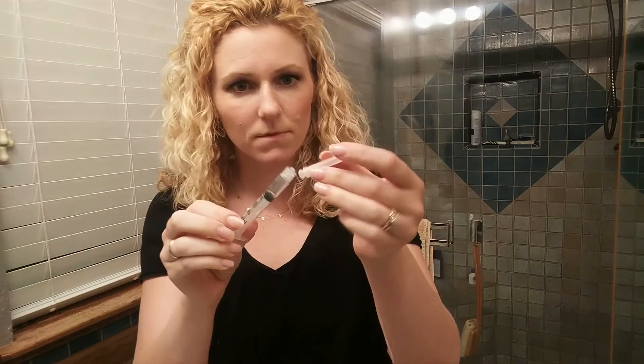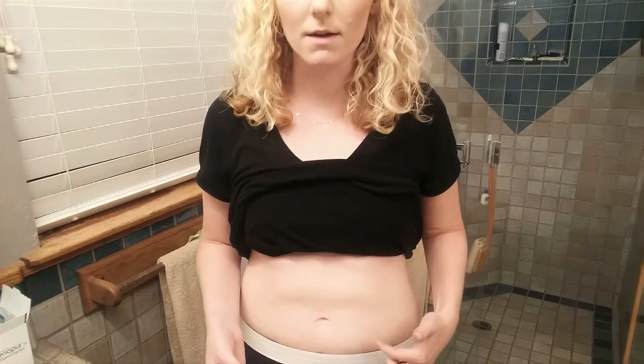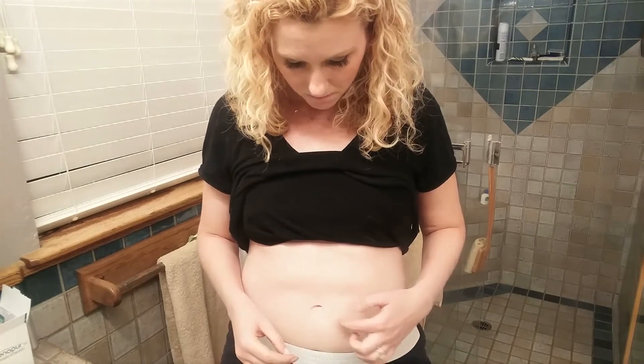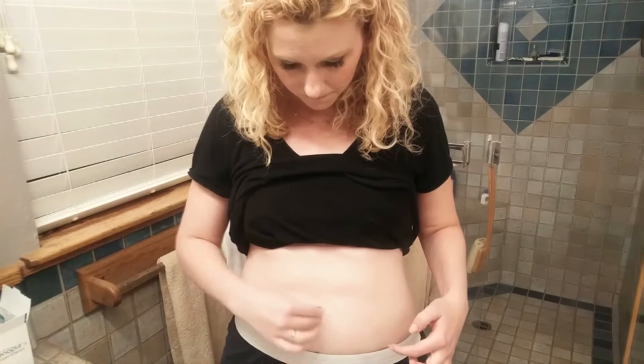Now I need to alcohol swab my body. Yesterday I did everything on the right side, so now I'm going to do the left side. You want to be around the belly button, but at least an inch away from the belly button — that's what I have heard and read. So for this one we'll just go right here. Clean that up. Then you want to let it dry — that's really, really important — because it'll sting really bad if you put the injection in when it's not dry.